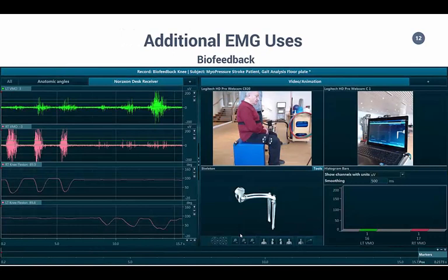Other than physiological and biomechanical research, EMG has been developed as an evaluation tool in applied research, physical therapy, rehabilitation, sports medicine and training, as well as ergonomics research.